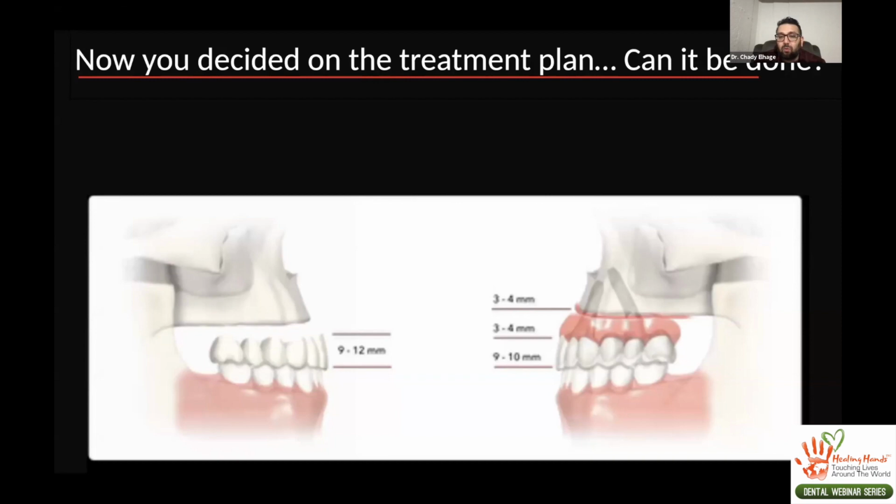Just about everything I do is monolithic zirconia with some sort of staining porcelain on there. I have found that that reduces the maintenance, reduces the chance of things breaking. If something's going to break, the prosthesis is going to snap, break in half. And at that point, for us to remill or reprint something for you in a matter of hours, a day or so, it's not the end of the world.